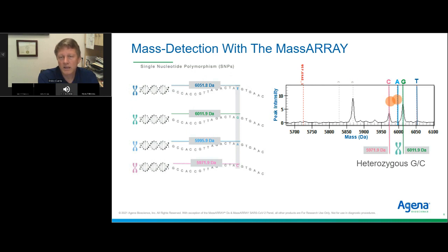And what you see here in this particular case, and this is an oncology marker actually, there's a C allele and there's a G allele. So we know this sample is heterozygous. The other thing we also know is the peaks are different heights here. So we know also, because this is an oncology marker, that this particular sample has a cancer fraction of about 30%. In CF, these peaks are normally the same height, because in CF, we only report out two alleles, heterozygous normally.